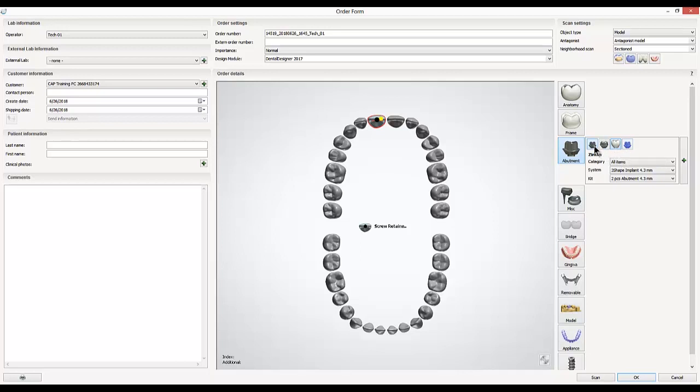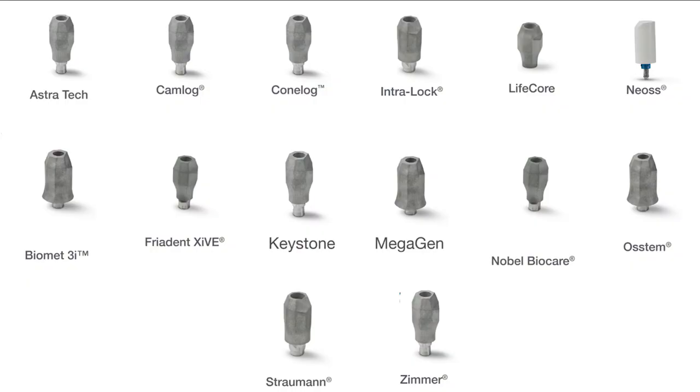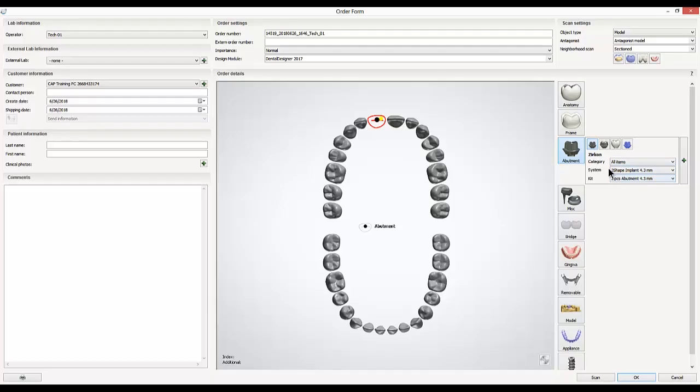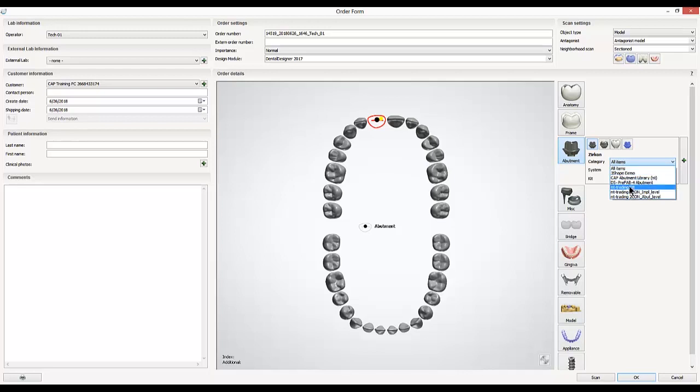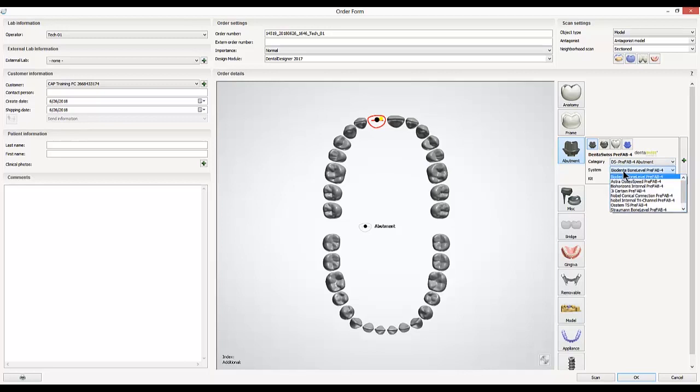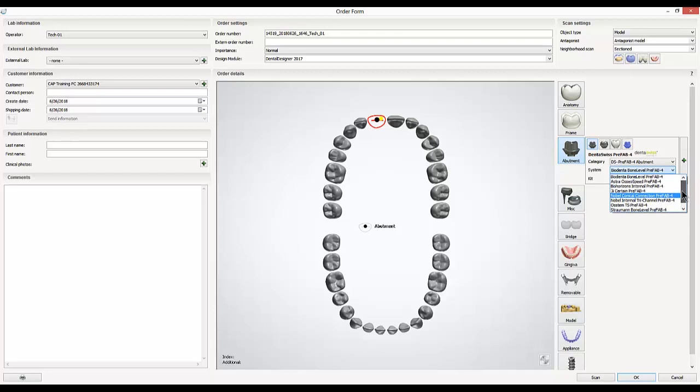In this case, I'm going to be doing a standard custom abutment. Within that, you'll always have to make additional choices for what brands you're working with and what systems and sizes you're working with. Category is a field that you don't necessarily have to use. You can use this to sort through different manufacturers' groups of systems. Otherwise, you can leave it on all items and browse through all of the systems available.